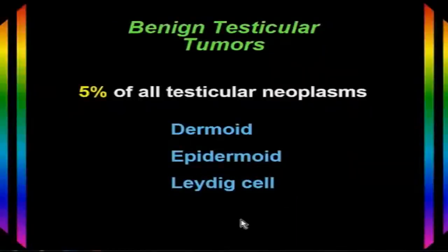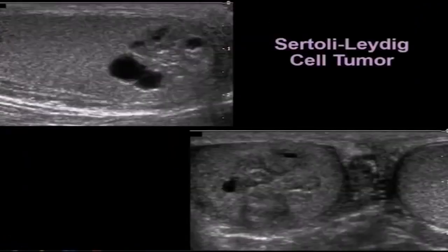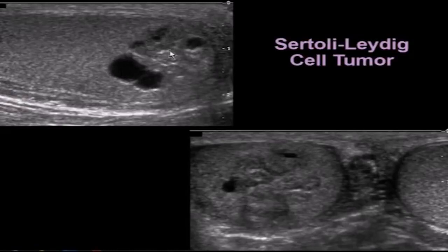About 5% of intratesticular tumors are benign lesions. When they are benign, they're typically dermoids, epidermoids, or Leydig cell tumors. Here we can see a Sertoli Leydig cell tumor that was benign but has the same appearance as testicular cancers — it's a well-defined lesion in the lower pole of the testicle with some cystic areas but mostly solid.